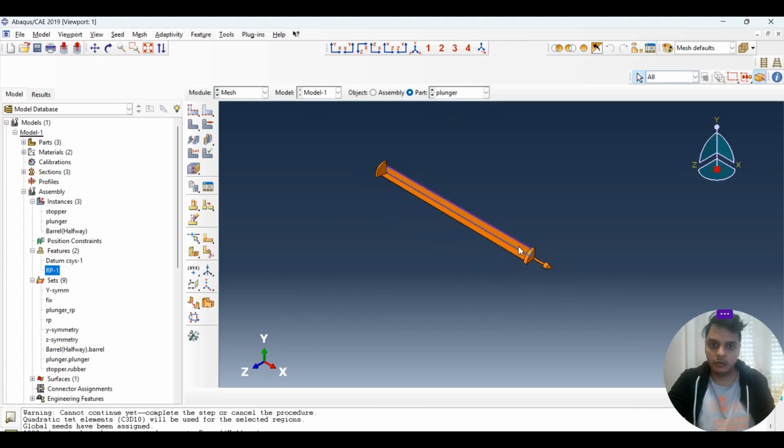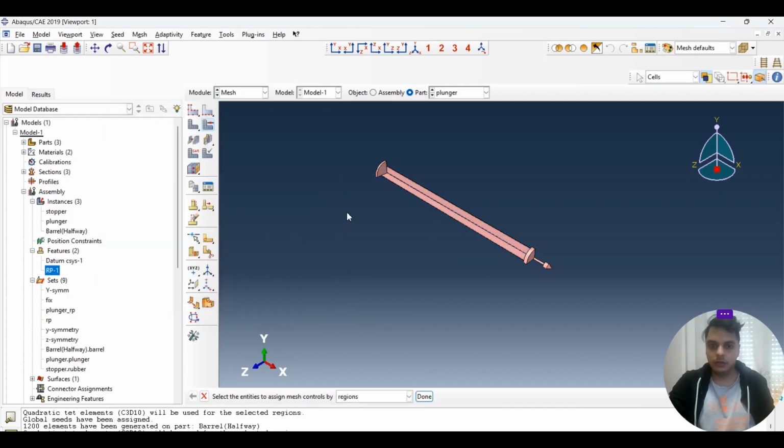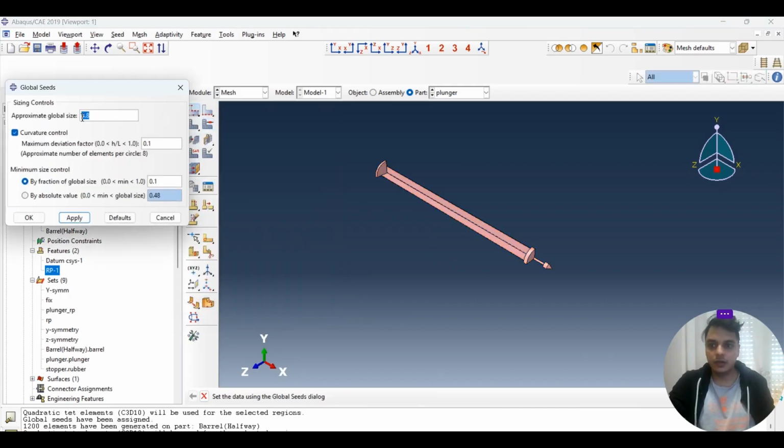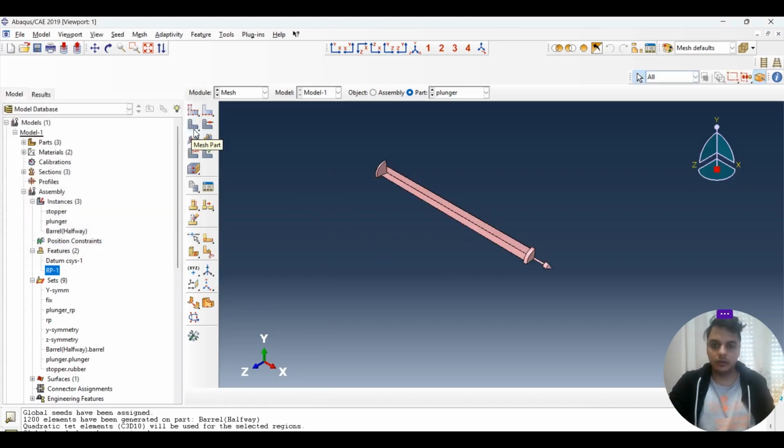Barrel. So the plunger also, again, we need to either do the partition to define hex mesh, but I'm okay as of now with the tet mesh. Again, I want to define 2 mm as a size. Also, make sure Abaqus is a unitless software, so you have to be consistent. If you've decided on millimeters, just check it from your CAD software. Then you have to choose all the dimensions according to that only.